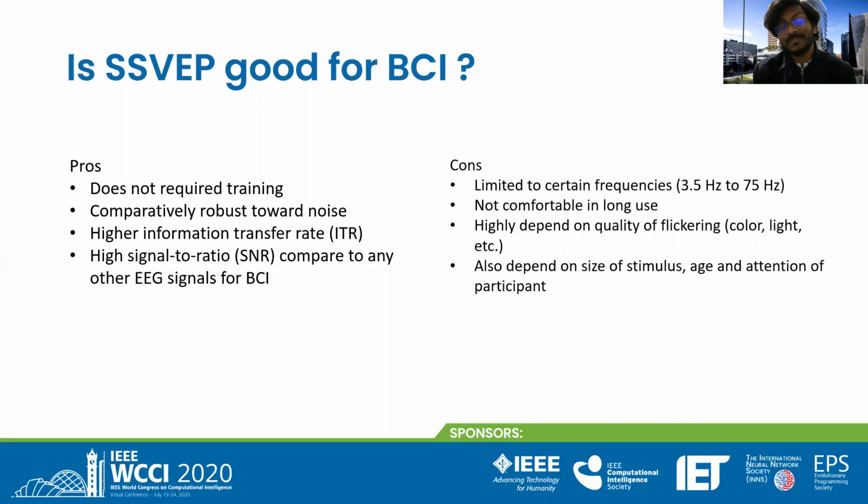Well, next thing is, if you're presenting that on the monitor, like I just presented to you, it depends on whether your monitor has good brightness, good light, good color or not. And also, more importantly, it depends on the refresh rate of your monitor, which is more of a technical issue, but it really has a high dependency. It varies a lot from one monitor to another monitor when you develop a system.